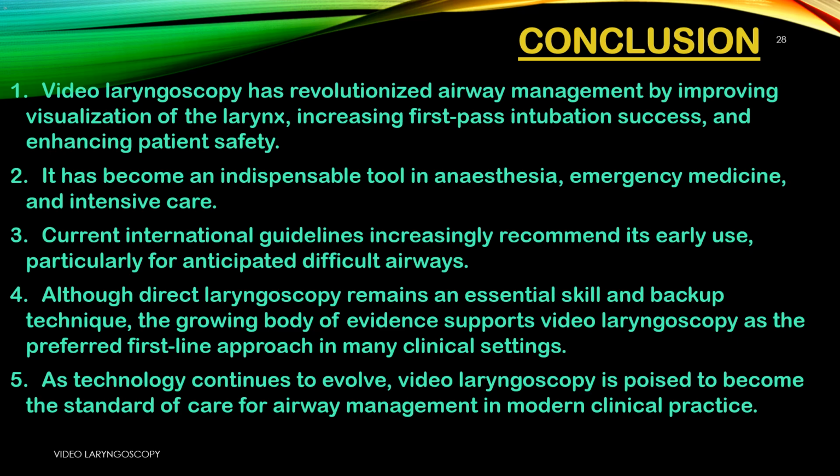3. Current international guidelines increasingly recommend its early use, particularly for anticipated difficult airways. Major airway societies say to reach for video first when you expect a hard intubation. 4. Although direct laryngoscopy remains an essential skill and backup technique, the growing evidence supports video laryngoscopy as the preferred first-line approach in many clinical settings. Doctors still need to know direct, but research shows video is better as the first choice most of the time.